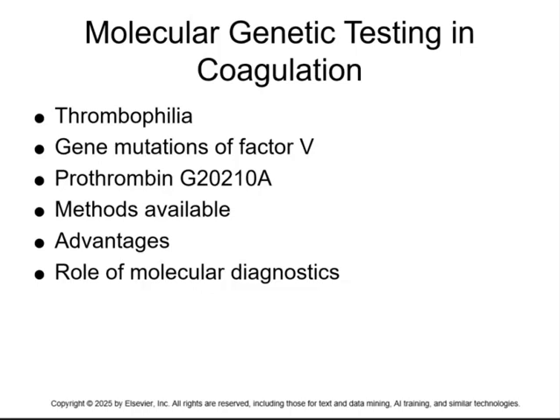With molecular genetic testing, it gives us really fast results, like the Cepheid GeneXpert. It can do a lot of that testing. So molecular is definitely the way things are going, for sure.